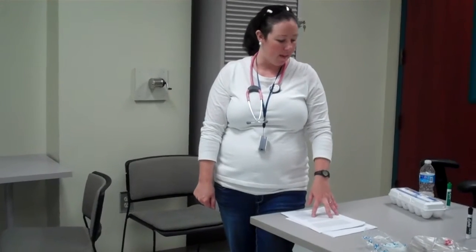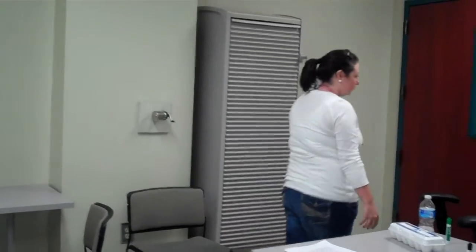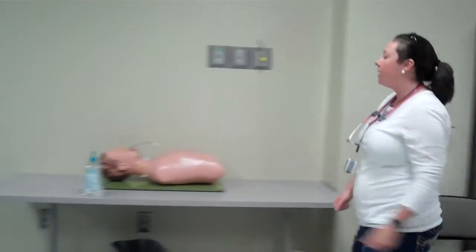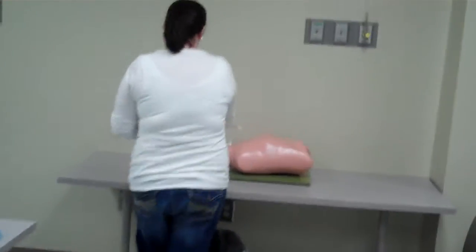After you're sure that you have a valid order, you've got valid settings — the T-bar at 40% and you know that you need to do a double high flow — go for it. I've got my equipment together, so I need to wash my hands. As I'm coming in, I'm introducing myself to my patient. Hi, my name's Ashley. I'm from Respiratory.